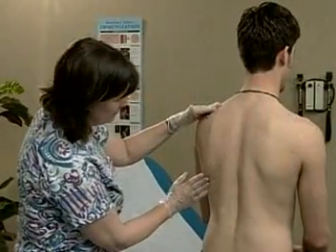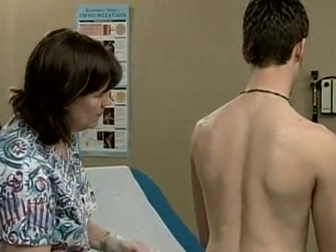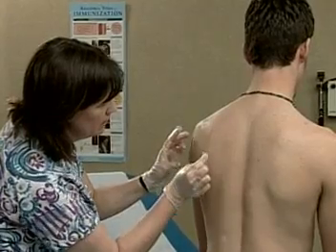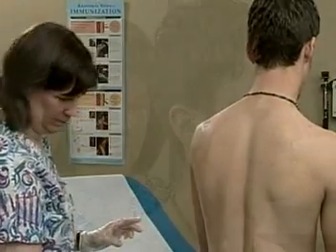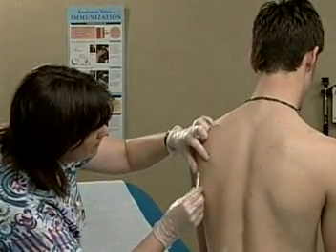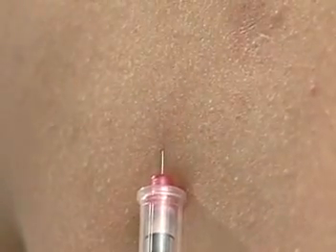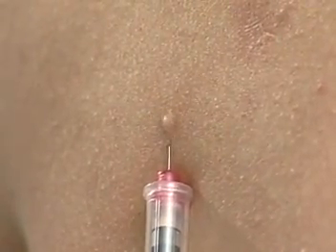Locate the scapular area. Choose the injection site. Okay, spot here. Clean the site. When the site is dry, stretch the skin taut. All right, Todd. Insert the needle. Stabilize the syringe. Inject the medication.